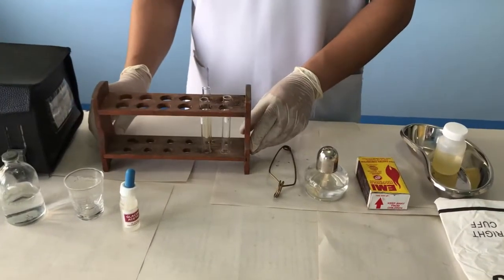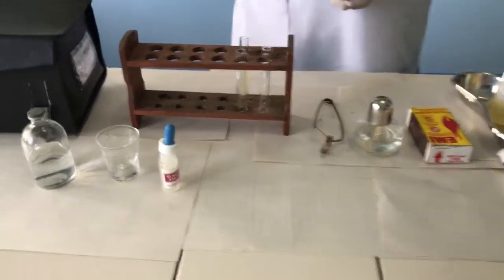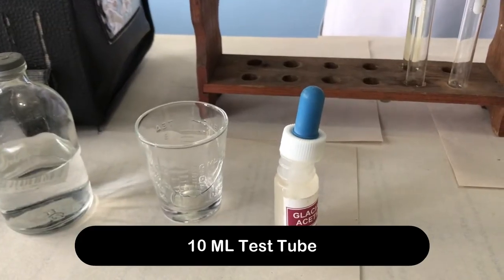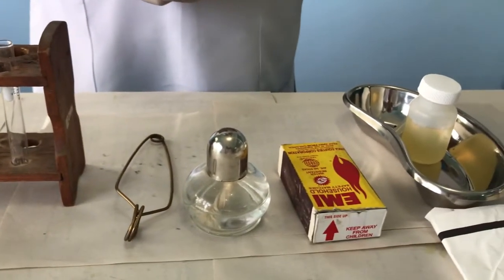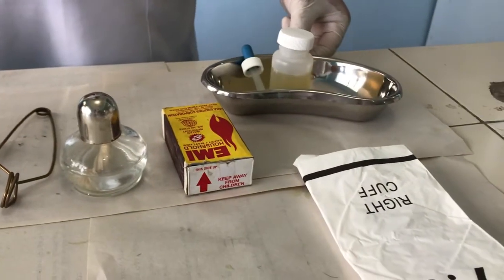Test for Albumin: Heat and Acetic Test. Materials needed: Acetic Acid Solution, 10 ml test tube, test tube holder, alcohol lamp and match, dropper, urine specimen, and lab gloves.